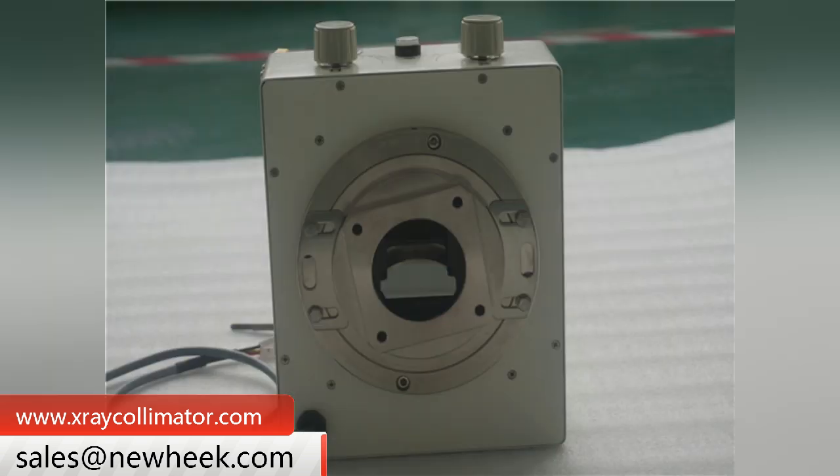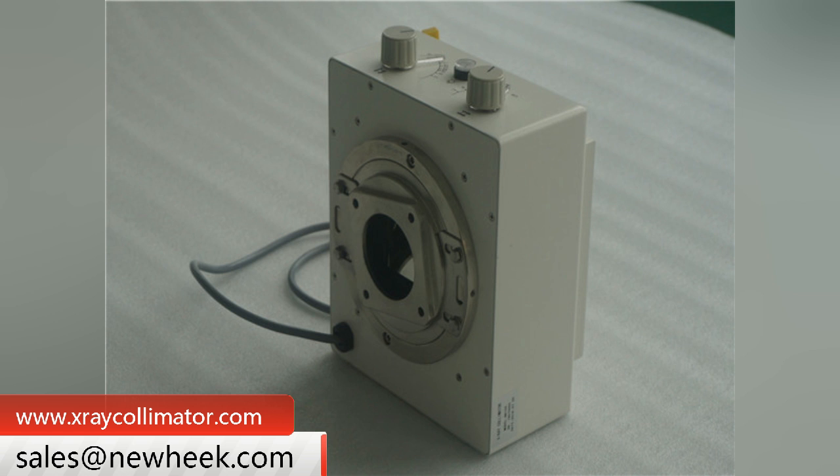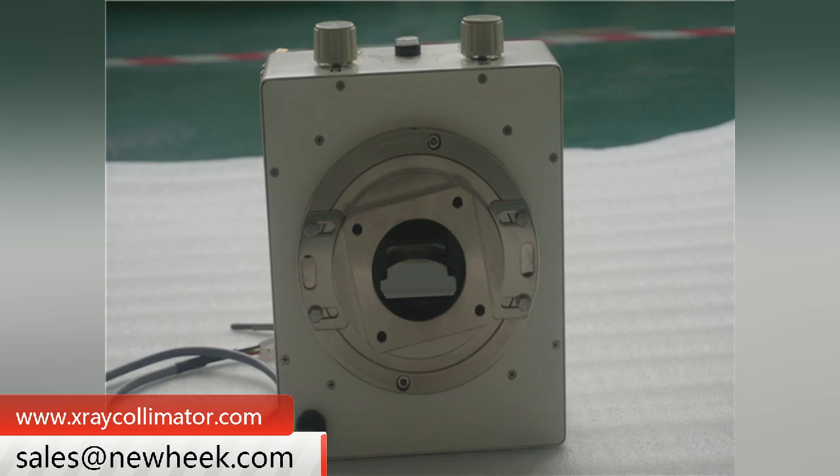Nuheek beam limiter products use six pairs of blades to control the X-ray field of view, all of which are lined with lead. Two pairs are at the entry of the ray, two pairs are in the middle, and the remaining two pairs are at the exit of the ray.